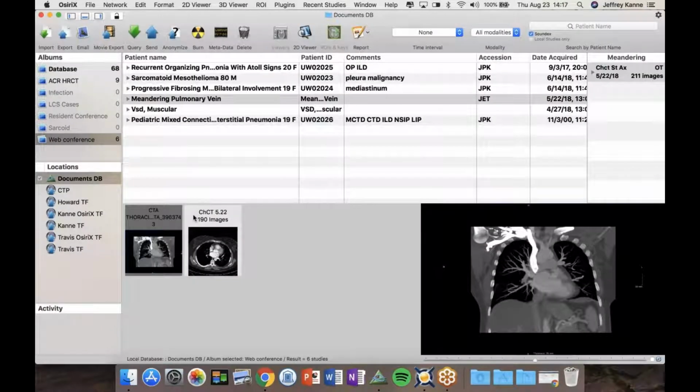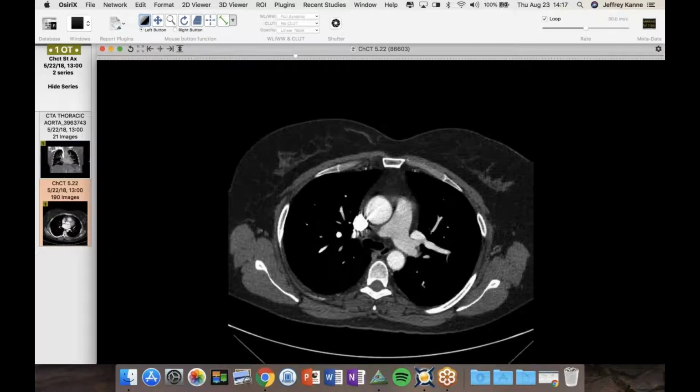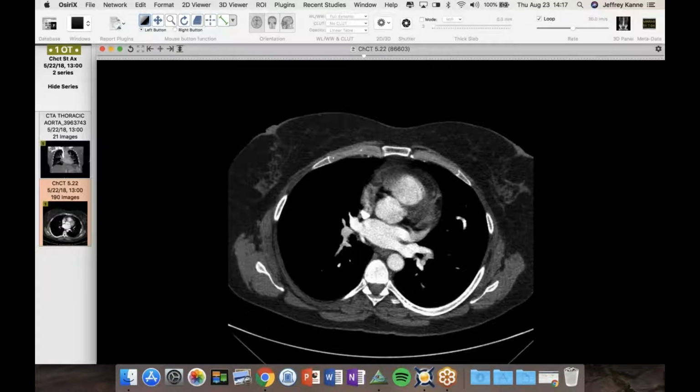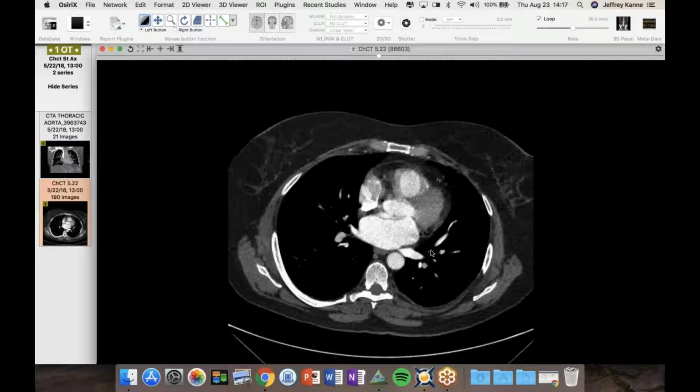But Jeff, this one does not connect. This doesn't connect a superior pulmonary vein to an inferior pulmonary vein. It's not a loop between those two. It's not actually connecting all the way back to the left atrium from that anterior thing that looks like an anterior pulmonary vein, right? It doesn't quite make it. Right. It just goes all the way back down to here. Which is the left inferior pulmonary vein. Yeah. So I think it's okay.